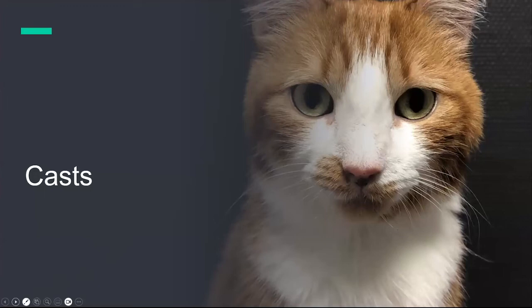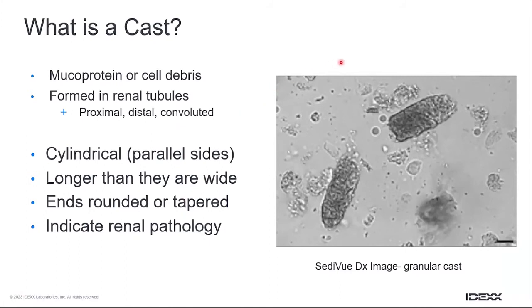Now, you probably have noticed, or maybe you will more so after this presentation, that actually finding casts on your report from an external laboratory is quite uncommon. And the reason for that is these are such fragile elements that unless you're looking for them in-house, it's quite likely that they'll have been destroyed en route to the lab. So can't impress on you enough, even if you are sending a sample to an external laboratory for urine analysis, please do have a look in-house as well. There'll be more information you can gain from that and compare and contrast with the information you're getting from the lab. It really is very important to look at this in-house and in as fresh a sample as possible.